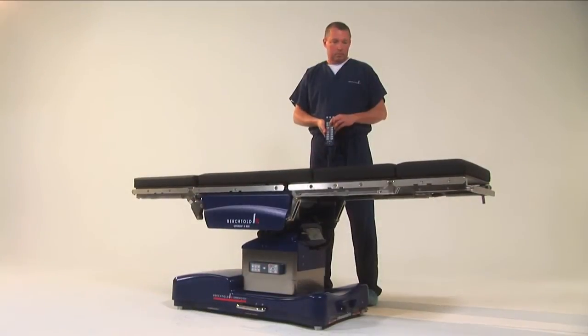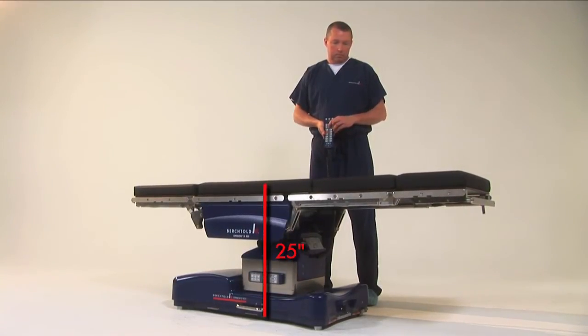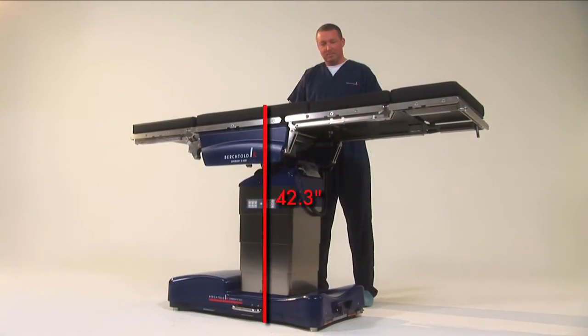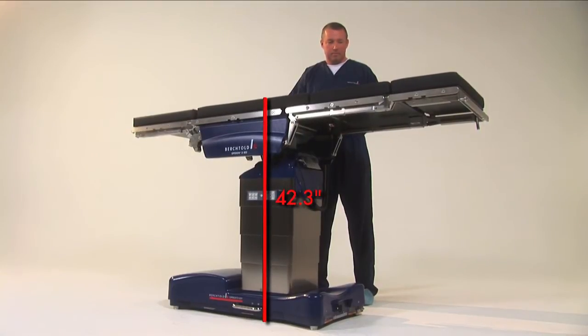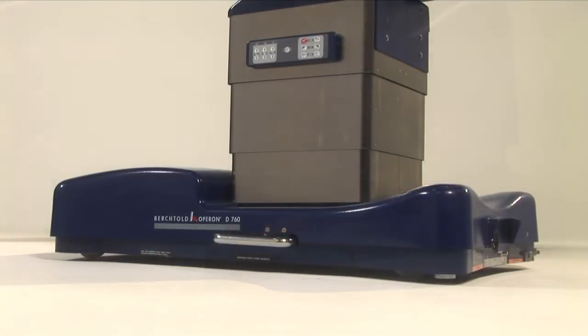Using the intuitive hand control, the D760 can be lowered to 25 inches or raised up to 42.3 inches, depending on the surgeon's preference and the required procedure. The self-compensating foot locks guarantee patient stability and safety, even if the OR has an uneven floor.